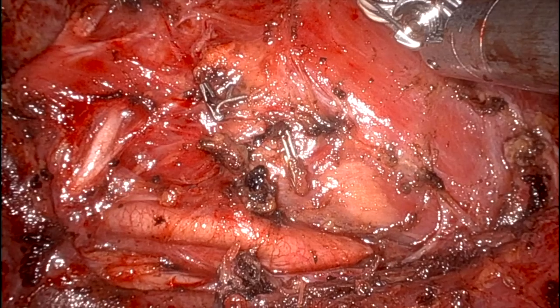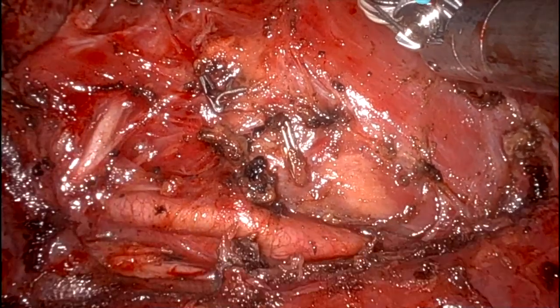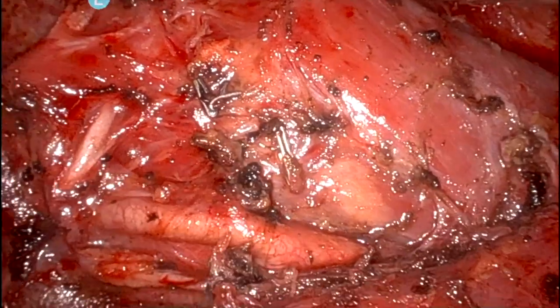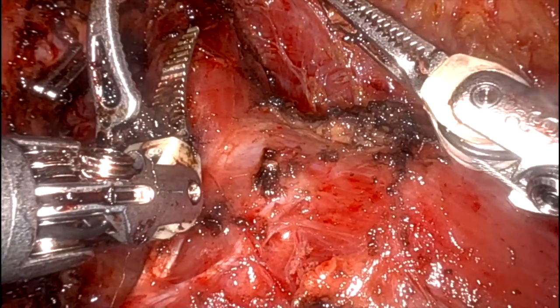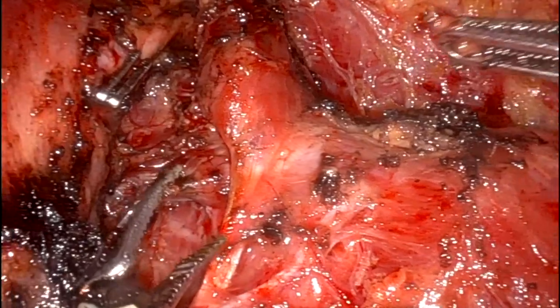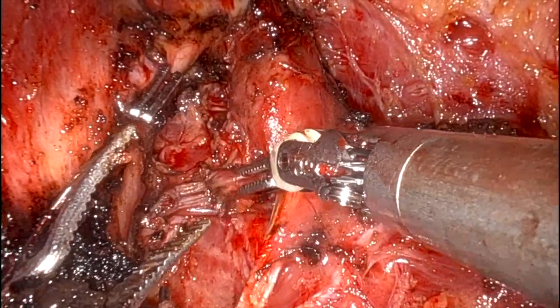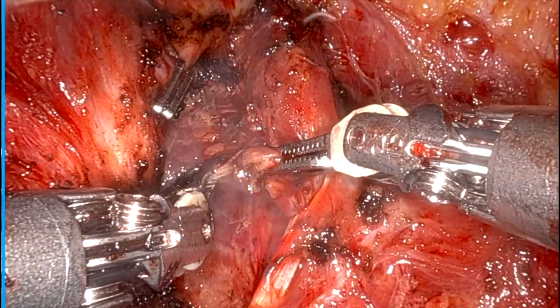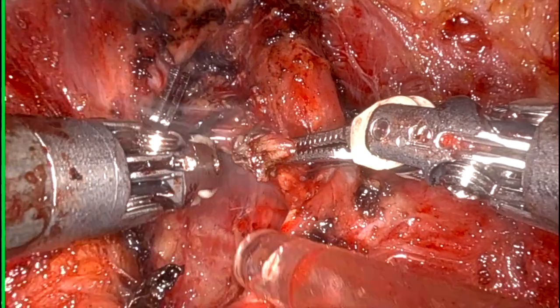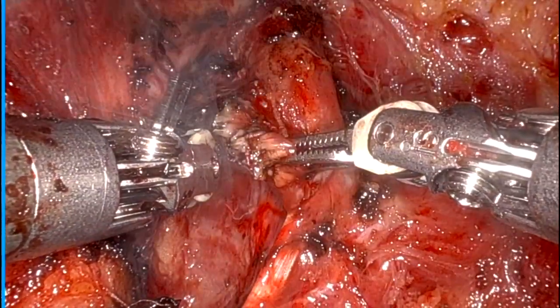So guys, this is a robotic supra-omohyoid neck dissection with a retroauricular approach. You can see the clearance, you can see the structures. One more thing I did in this particular case, that is cutting of the mylohyoid muscle, which is actually part of primary resection. So I adjusted my camera, held the muscle and started cutting. You can see the hypoglossal nerve below.